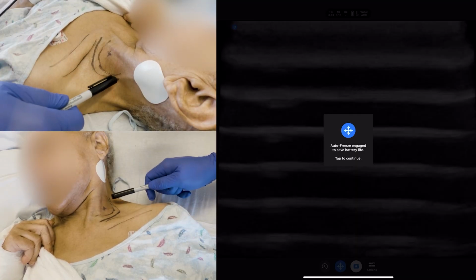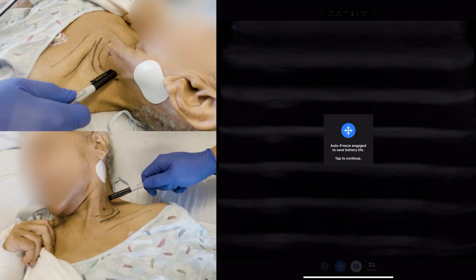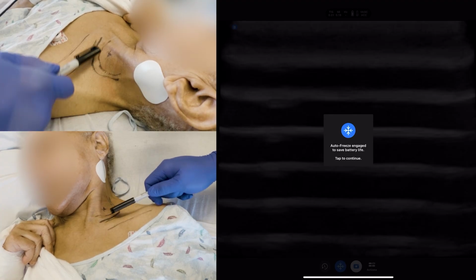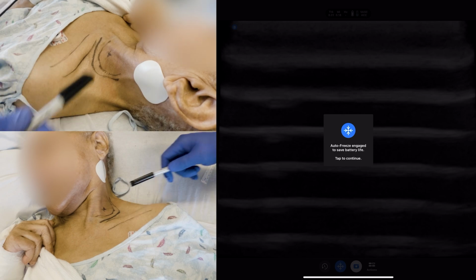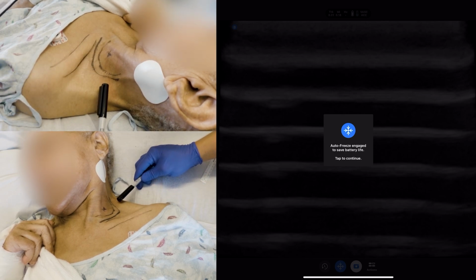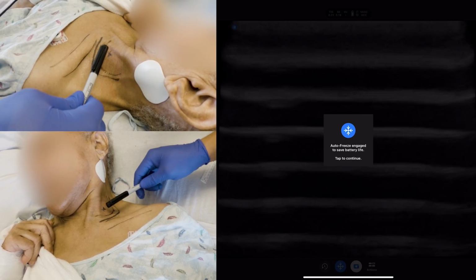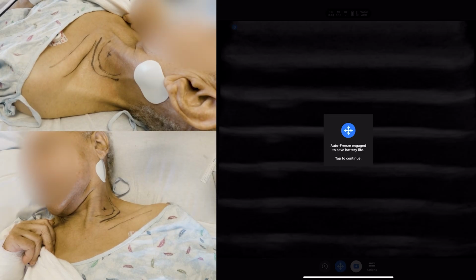Now, the patient has a looping EJ. This is very inconvenient because we can't tunnel with traditional tunneling, or else we're going to perforate that EJ, and that's going to be a big problem. So we're not going to do that. However, we are going to do a pseudo tunnel, needle subcutaneous tracking, basically needle under the EJ and try to get to that IJ spot.